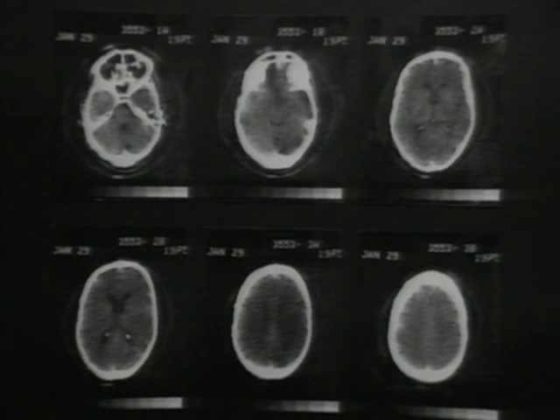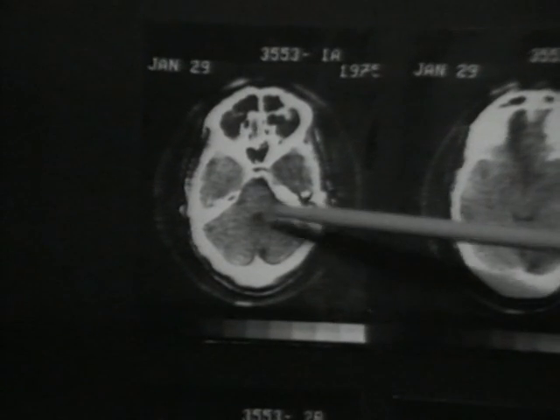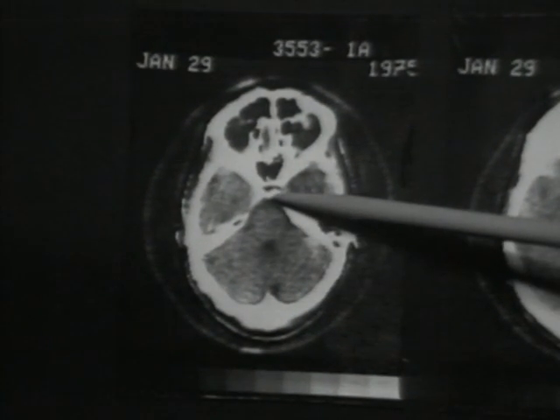The perspective differs from that to which we have become accustomed in conventional radiographs, and we may have to cast our minds back to our medical student days when we were accustomed to looking at transverse sections of the brain. However, the importance of the display is that living anatomy may now be shown quite simply and with no particular discomfort to the patient.